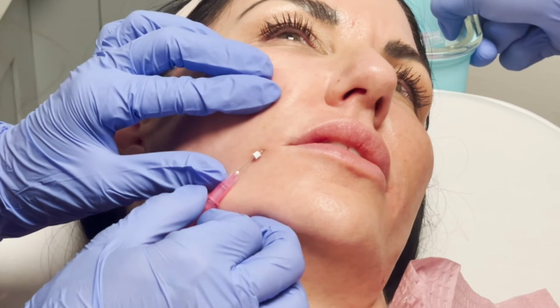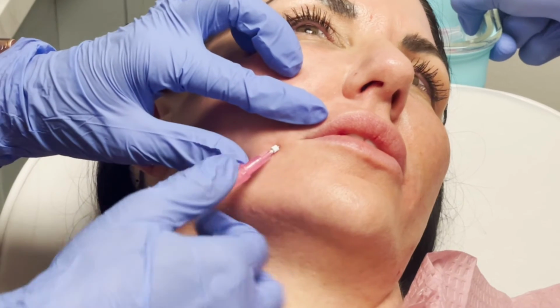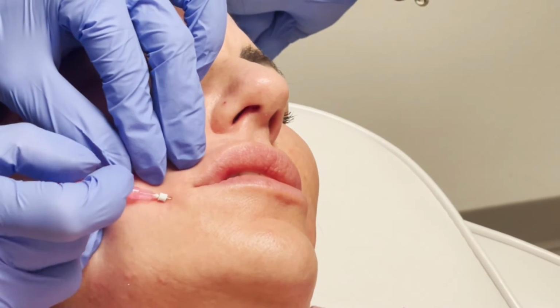Finally, I'm taking the twist and I'm putting them into deep folds. Marionette area, deep folds. Nasolabial, deep folds. Glabellar lines, deep folds. So any deep folds, I'm usually putting in. If you've ever seen people with these lateral necklines, or we call them tech neck because we're all on our phones and computers creating this wrinkle, if I put those twists right into those folds, it helps break up the wrinkles because I'm subcising mechanically, trying to break up those wrinkles with that needle. And then the second part is when that twist or that slinky opens up, it gives a filling effect without adding bulk or volume into places we don't want.